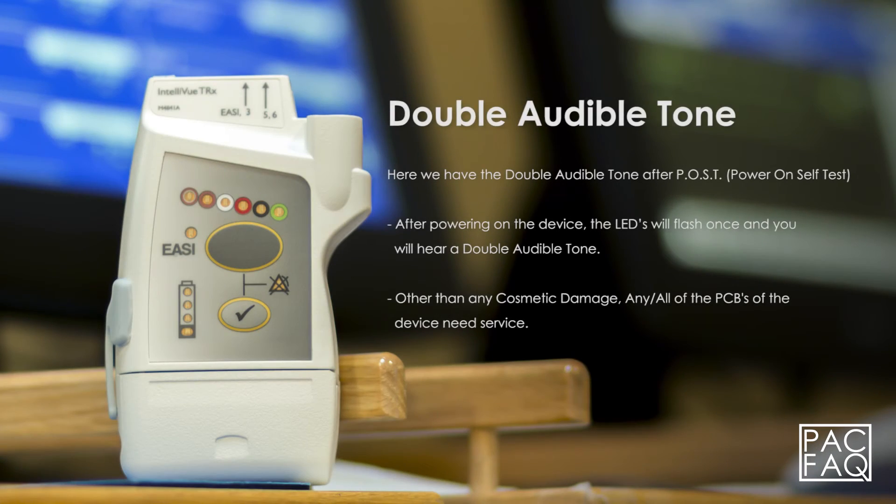Here we have the double audible tone after POST, power on self test. After powering on the device, the LEDs will flash once and you will hear a double audible tone.